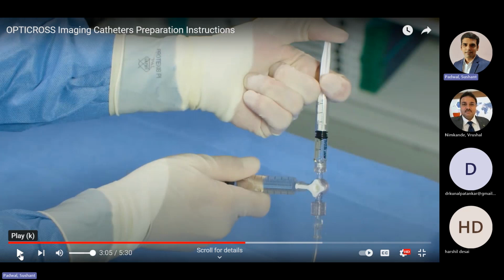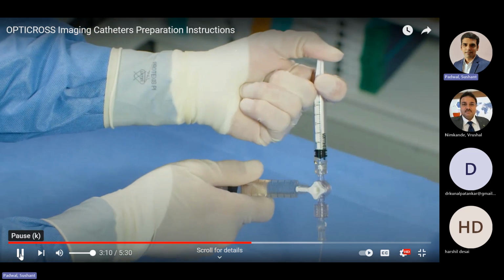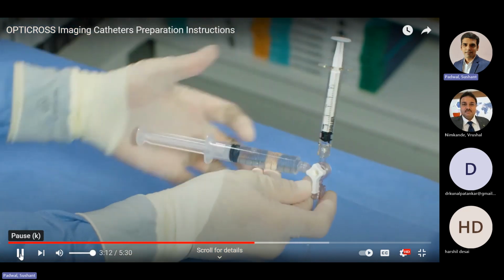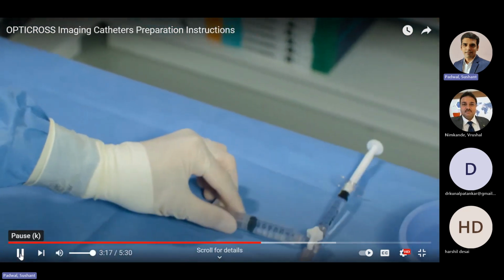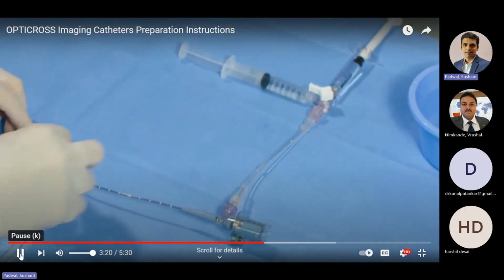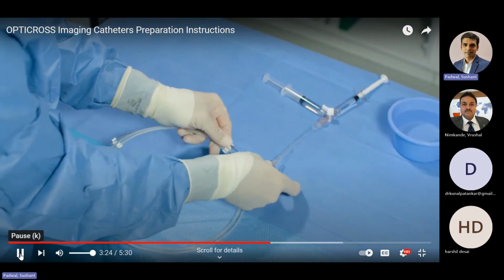If you flush it twice with 3 cc, it will completely de-air the system and you will get a good quality image with no air bubble or micro bubble entrapment. Refill the 3 cc syringe. Once complete, fully close the telescope by retracting the telescope to the hub.